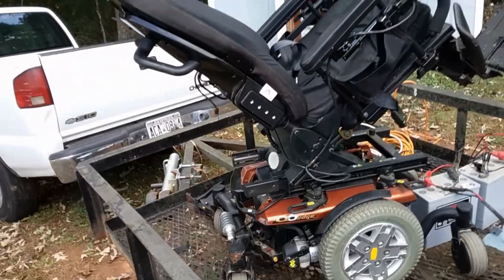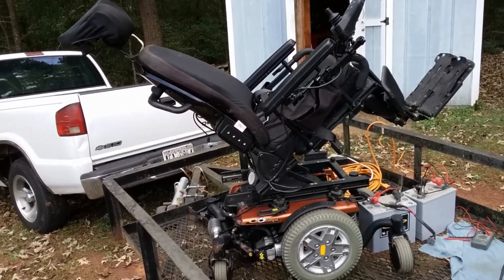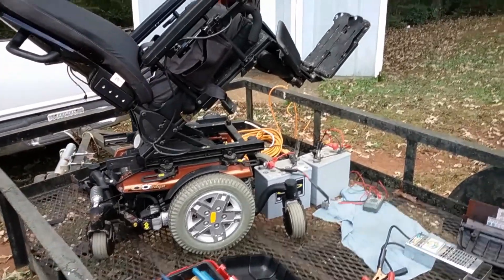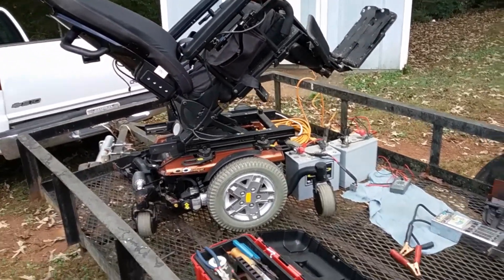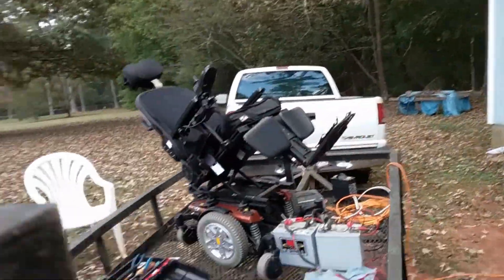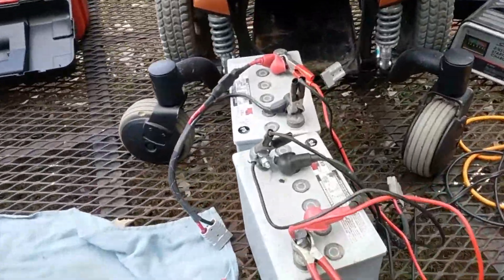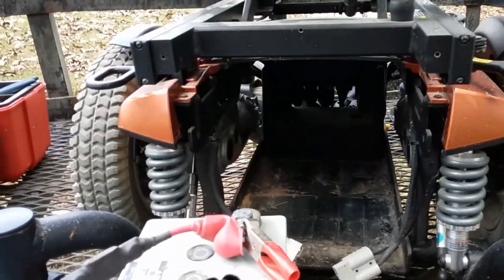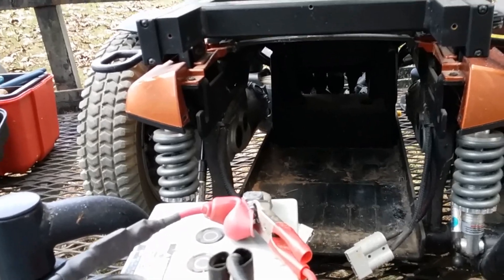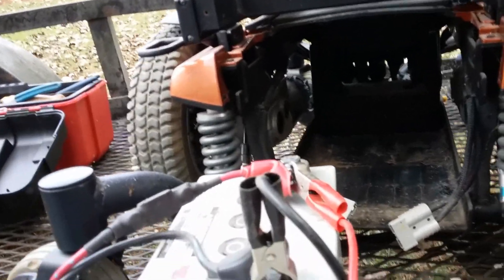As you can see here, I've got it tilted all the way up. That allowed me to get to the two batteries that were inside. There are the two batteries — they go up inside that hole on the front of the chair. To get to them, you have to remove this cover here first.